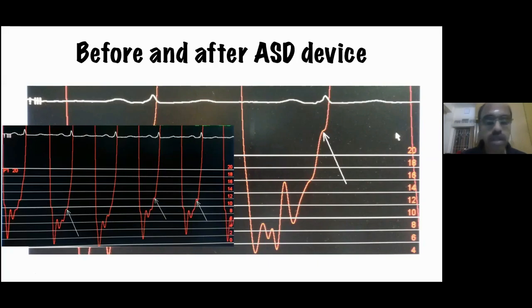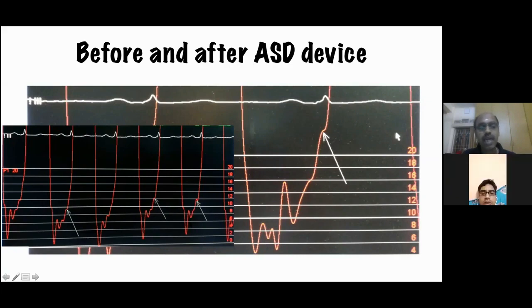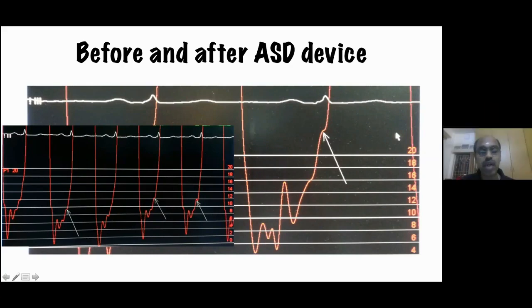Now, yesterday what I was mentioning was, carefully keep looking at what is the basal left ventricular end diastolic pressure. If the basal left ventricular end diastolic pressure is at the highest level of normal, what is a normal high? The upper limit, it is 12 millimeters of mercury. So if you are touching 12 millimeters of mercury, there is a possibility that there will be further elevation.